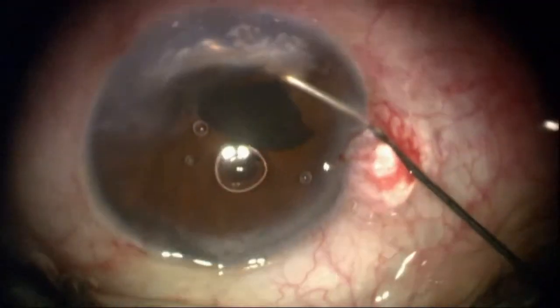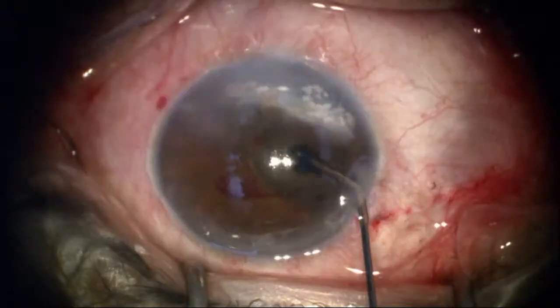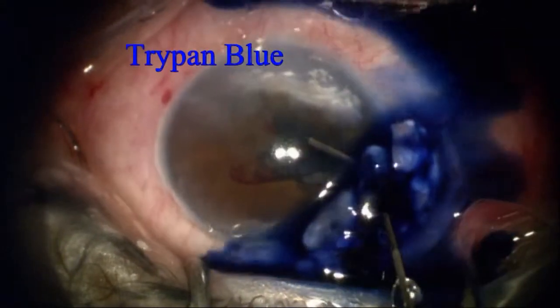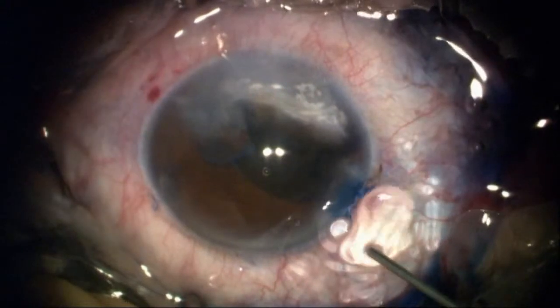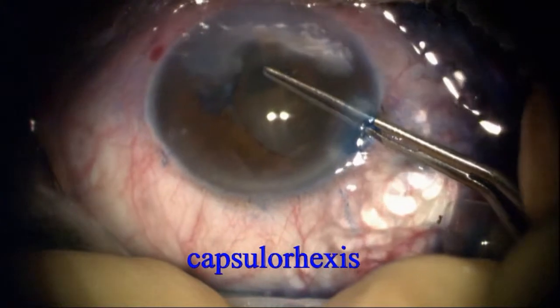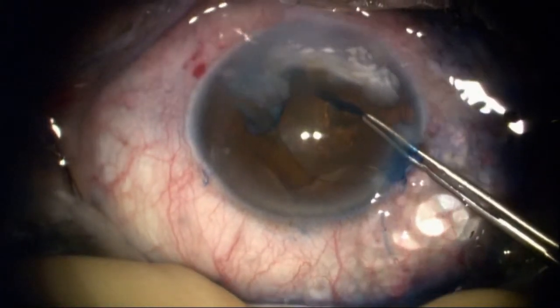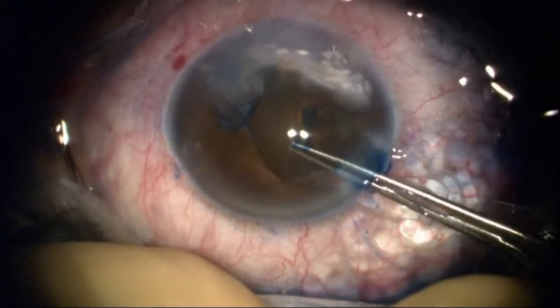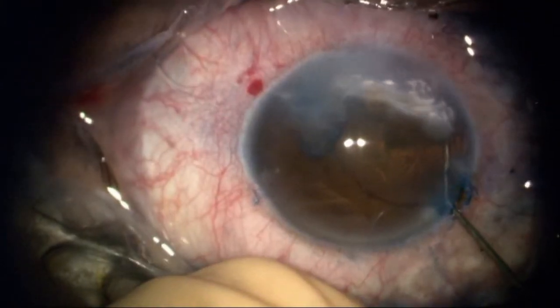The patient has a downward drawn pupil. It's going to be impossible to completely restore everything to normal, but here I'm using trypan blue to stain the anterior capsule, then evacuating it using viscoelastic and doing a small capsulorrhexis just because my visibility is somewhat limited, but I'm able to perform a complete continuous curvilinear capsulorrhexis.